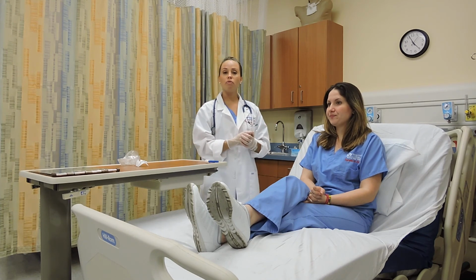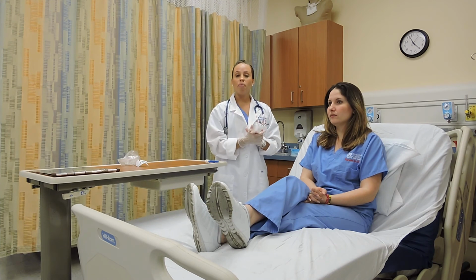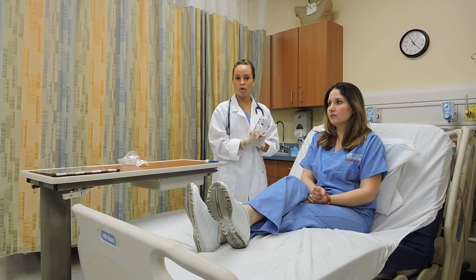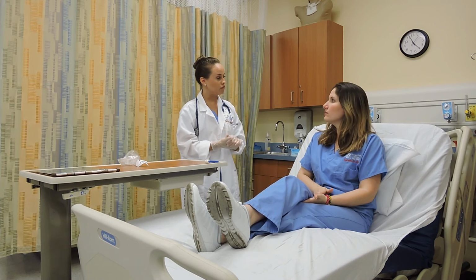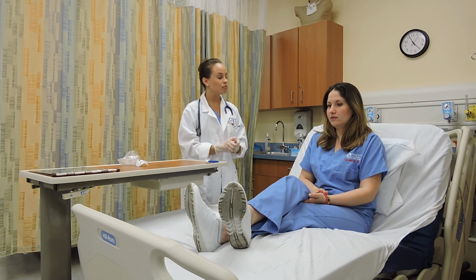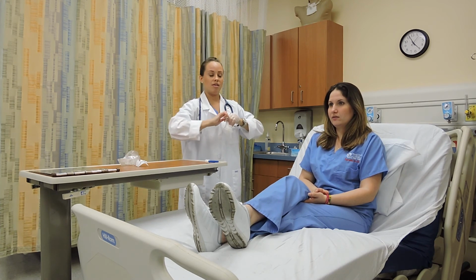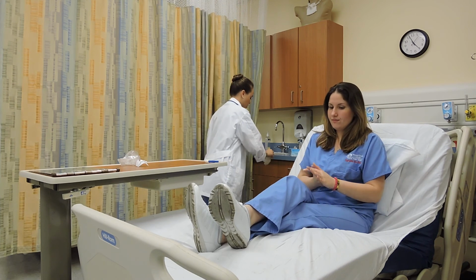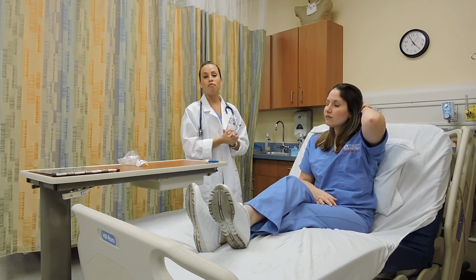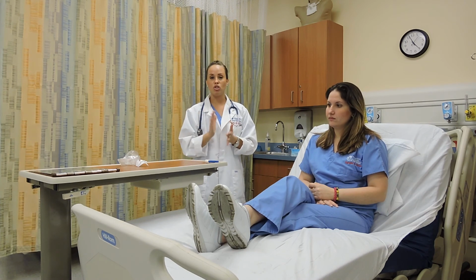Then you can go ahead and perform post-treatment vitals, and then ensure patient's safety and comfort. Ms. Sanchez, we're done for today. You did very good. Is there anything else I can do for you? No, thank you. All right, then remove your PPE. Discard it. Perform hand hygiene and document your findings in the patient chart.